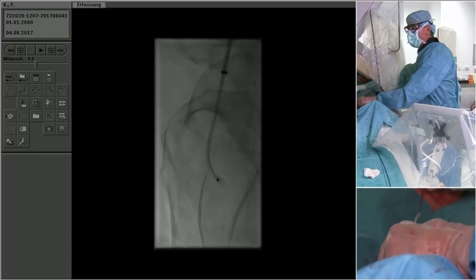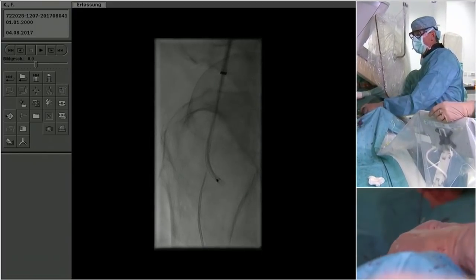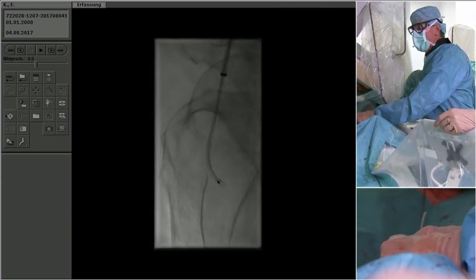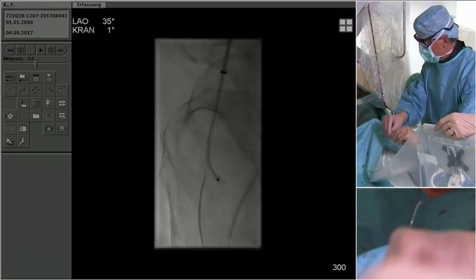This looks very promising. You look like you are very close, at least in this view. Yeah, and here clearly you need your time, because now you really want to take that wire and drill and check.